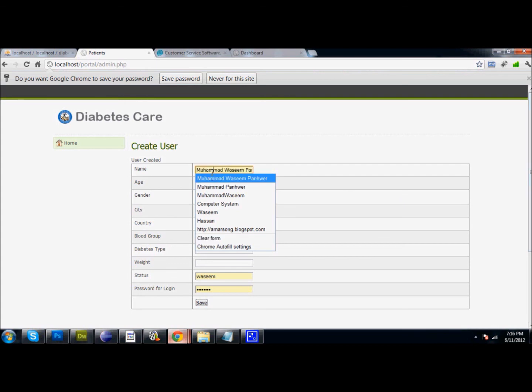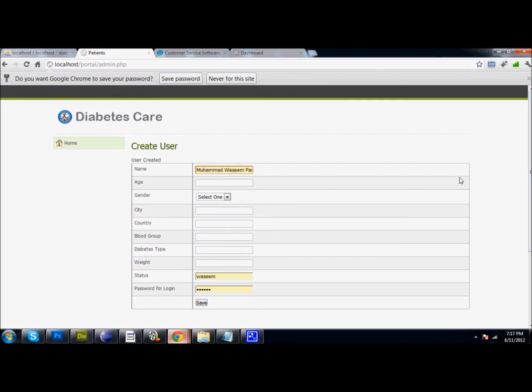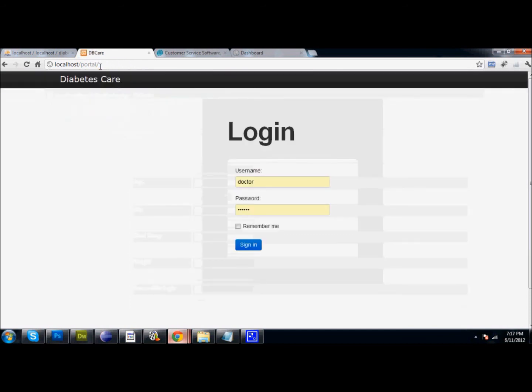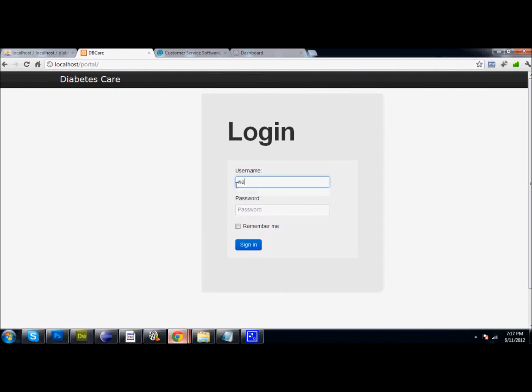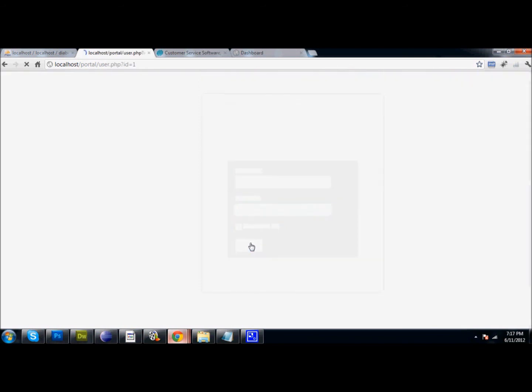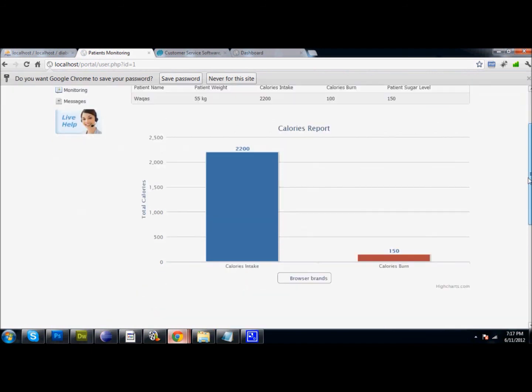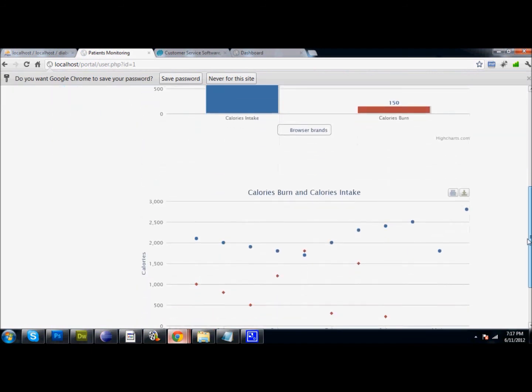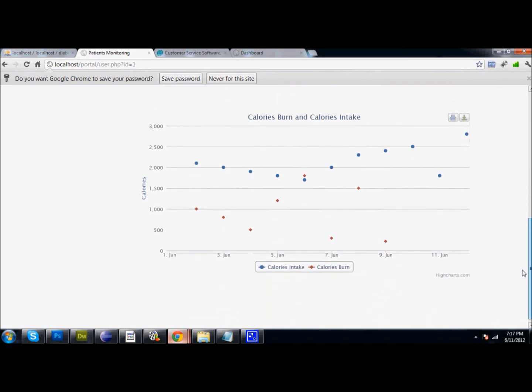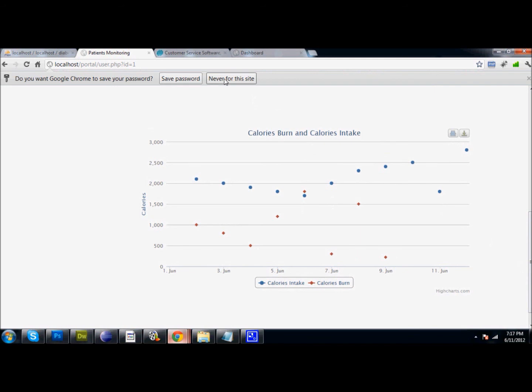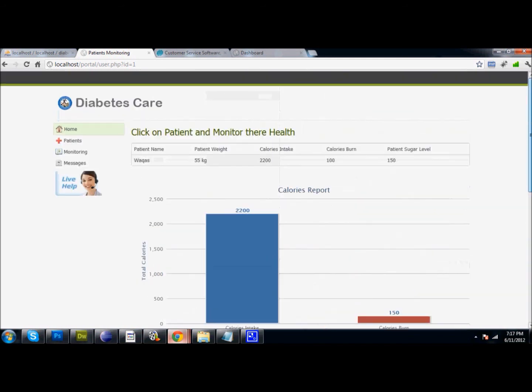The admin also enters the user's status and password for that particular person, whether they are a doctor or a patient. A patient can also log into the web application and see all their monitoring data — their calorie intake and burn history — view the chart, and that covers everything about the web application.